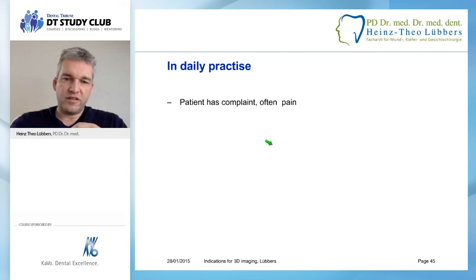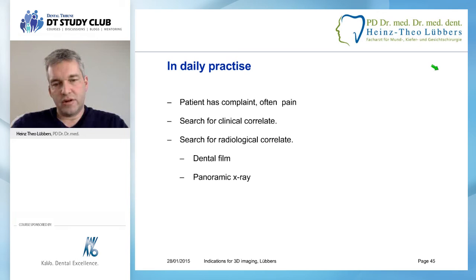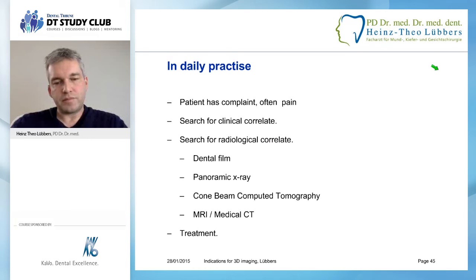In daily practice, the patient has a complaint, often it's pain, as I said before. We search for some clinical correlate, and we search for some radiological correlate: dental film, panoramic X-ray, cone beam computer tomography, whatever, MRI, medical CT. And finally, we do the treatment.